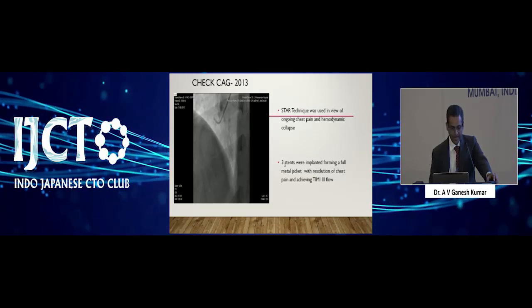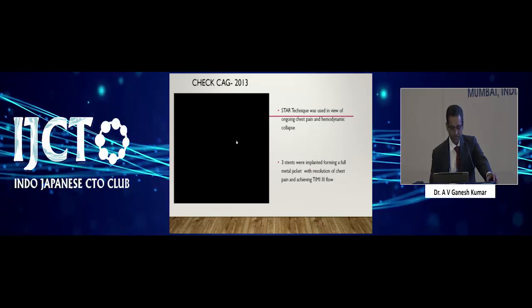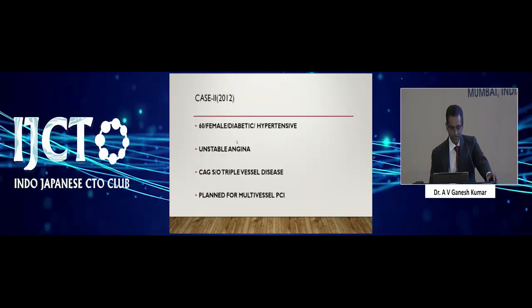3 years from then, I did a follow-up angio on him. Of course, the left side stents are patent, and this is how it looked. It looked beautiful, and even the PDA had come back. So this is one of the follow-ups of full metal jacket which I wanted to share with you.